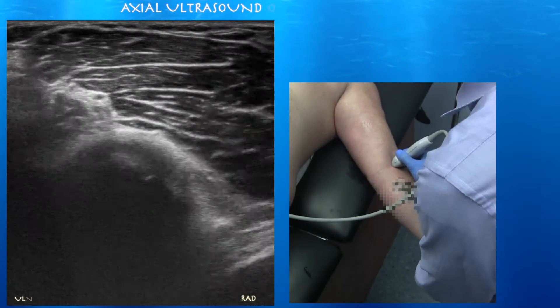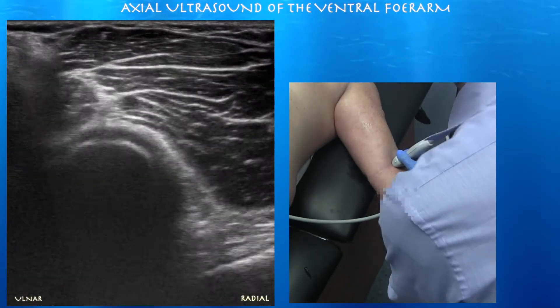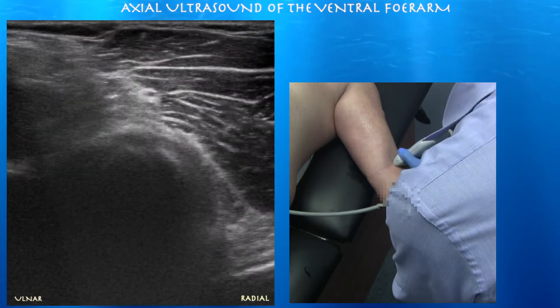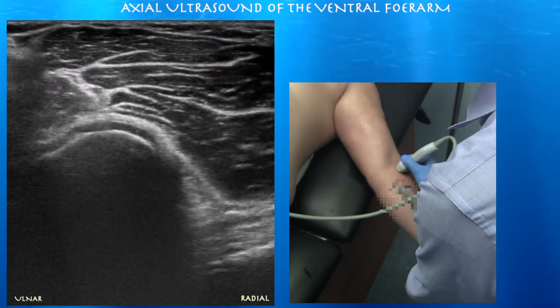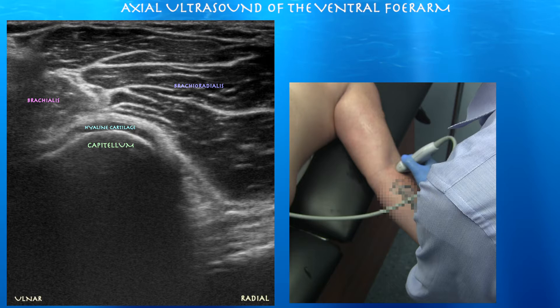We could just do some of the ventral musculature in the forearm. We're at 1855, so we're looking at the capitellum. Here we are looking at the hyaline cartilage over the capitellum. You can also appreciate the brachialis and the brachioradialis muscles.